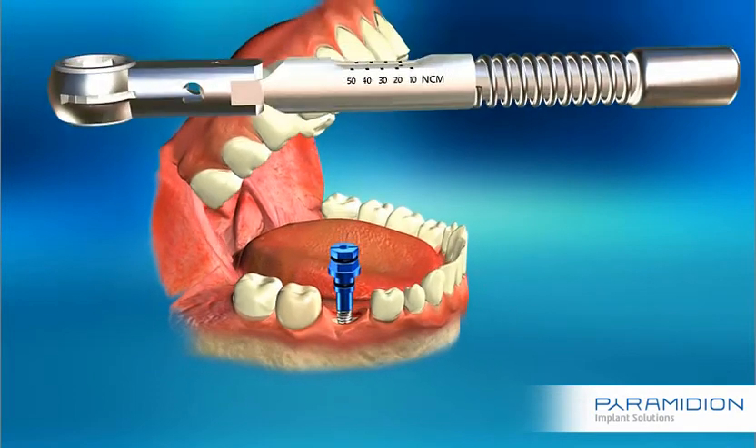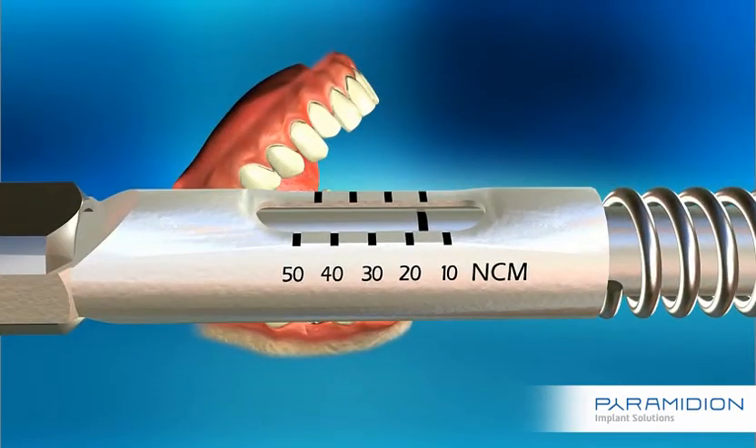Use the torque ratchet to bring the implant to the desired level. Exceeding 35 Newton centimeters is an indication of hard bone tissue.